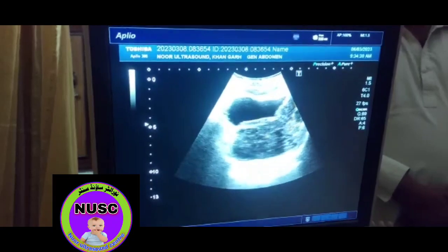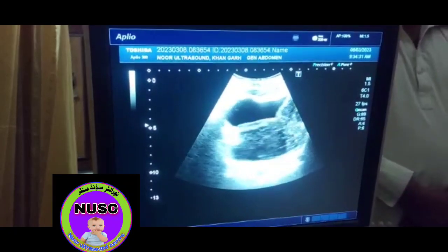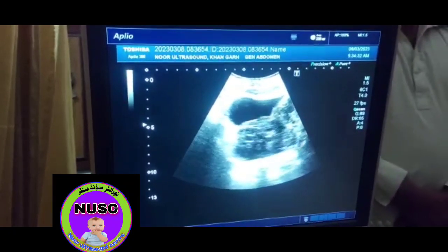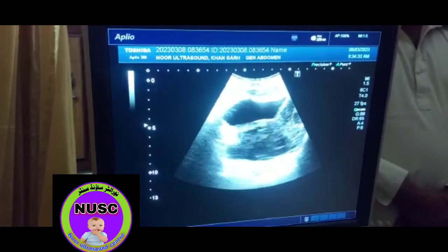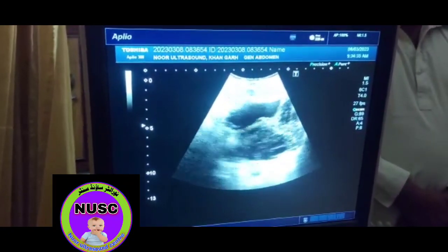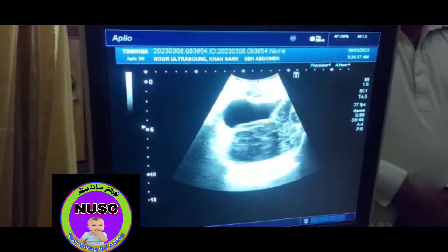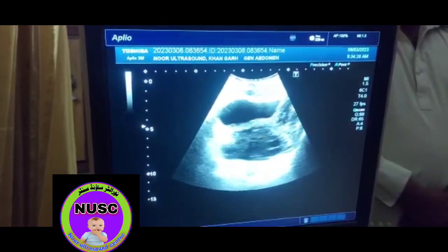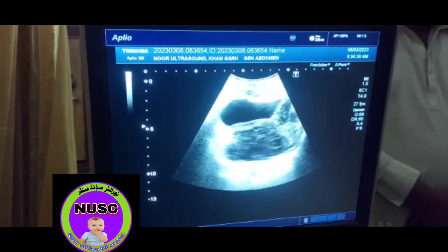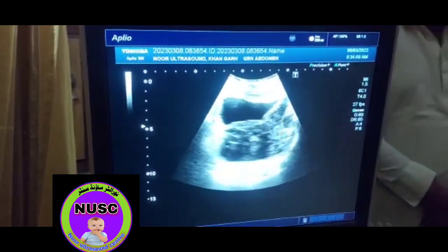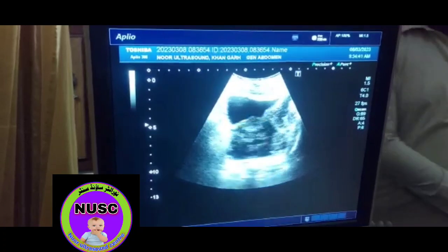We are performing an abdominal scan of a male patient, aged about 70 years, complaining of pain during micturition.